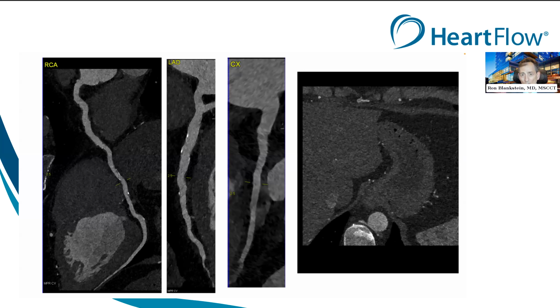And overall, I think in most of our patients, this would be a small amount of plaque, perhaps when you're just kind of looking at these quickly. But of course, because he's young, I think it catches our attention. A 32-year-old really shouldn't have any plaque, ideally. And when we look at the images, we actually start to see some more plaque.